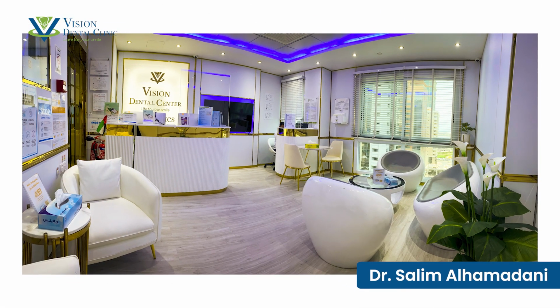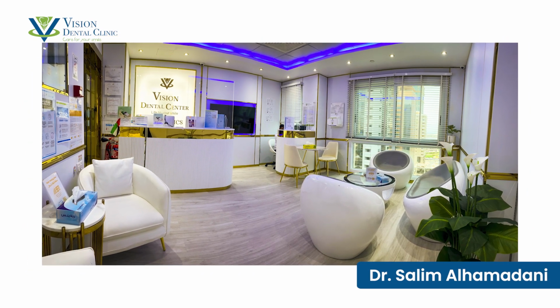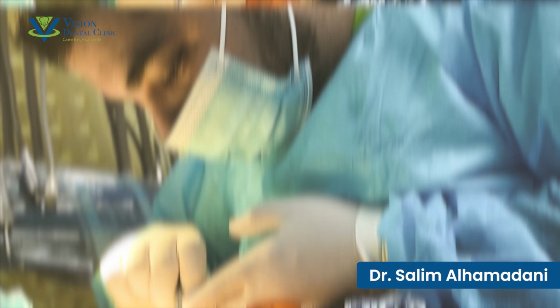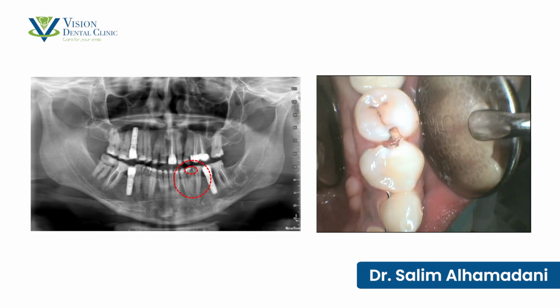The patient came to our facility complaining of pain and food impaction on the lower left back teeth. After using proper diagnostic tools we have in our facility, provided by our management, such as panoramic X-ray and oral photography, it was discussed with the patient that these teeth need root canal treatment and CAD/CAM restorations.